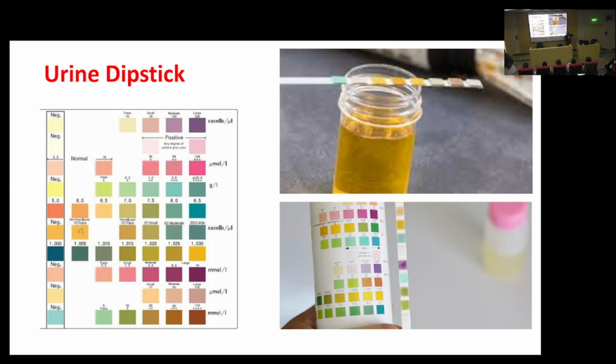One of them will react with sugar or glucose in the urine, and so on. Once they react with these chemicals in the urine, they will change color. And then you will see this color change, and you will interpret it based on your reference. So there will be a reference. It will tell you if there's a lot of glucose or no glucose based on the color change.